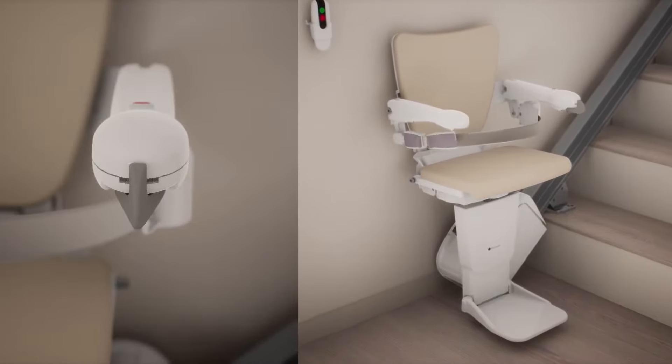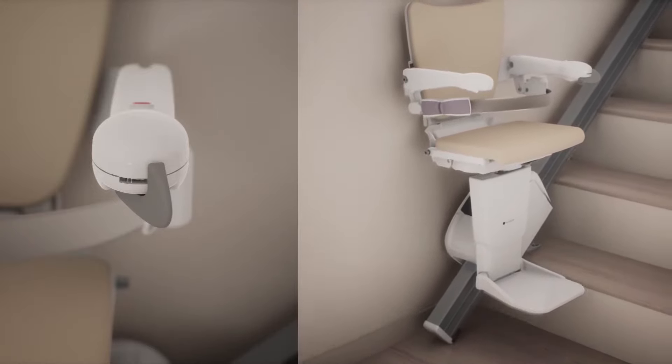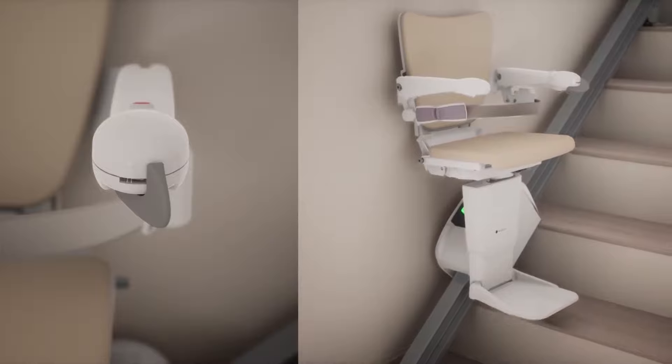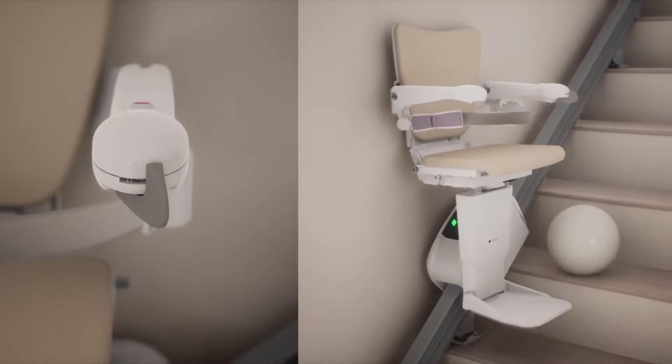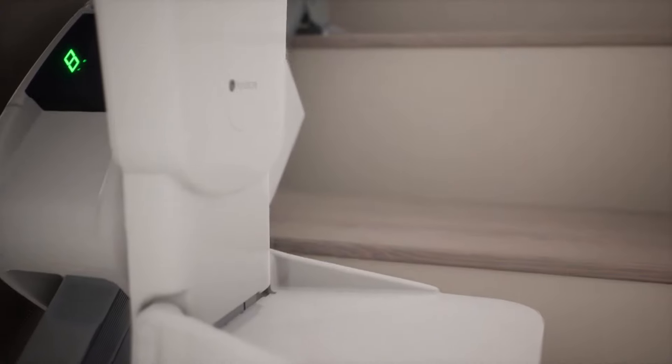To start the ride, simply push and hold the toggle. The stairlift will now travel in the desired direction. The Handicare 1100 is equipped with safety sensors, which will stop the stairlift should an obstacle be detected.